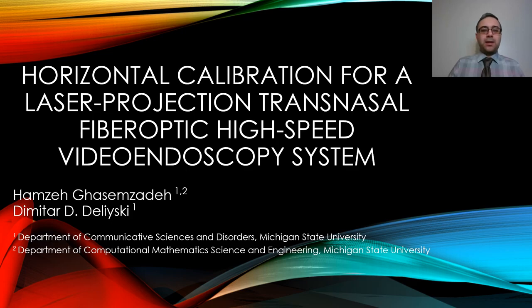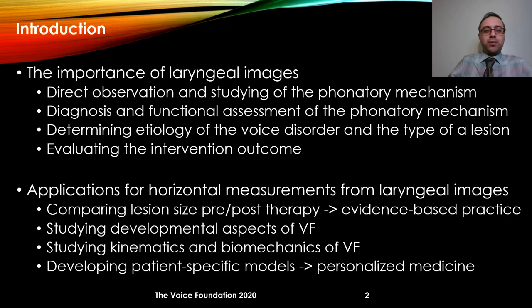In this presentation, I will talk about the method for horizontal calibration of a laser projection transnasal fiber optic high-speed videoendoscopy system. Images are an important tool for doing clinical evaluation and also basic science research.